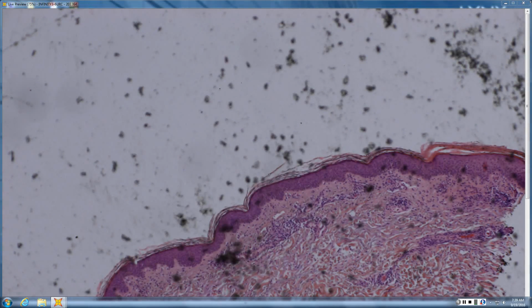I'm not sure. So you always think of drug when you see a mix like that. You think of various viral conditions when you see mixes like that. You think of syphilis when you see mixes of inflammatory patterns. And then occasionally lymphoma in the T-cell lymphoma group.